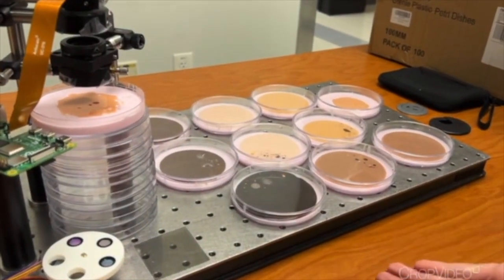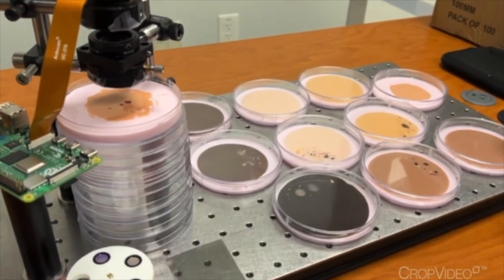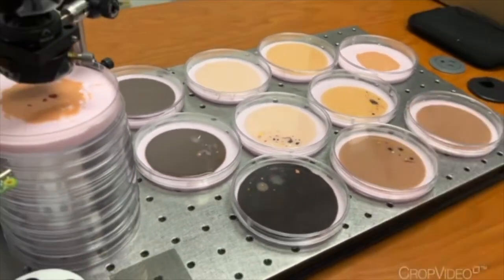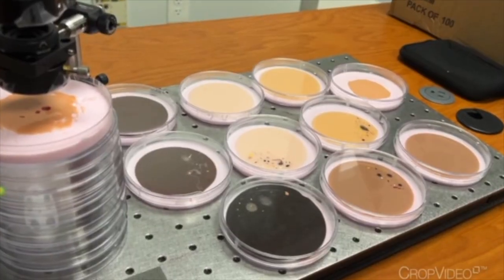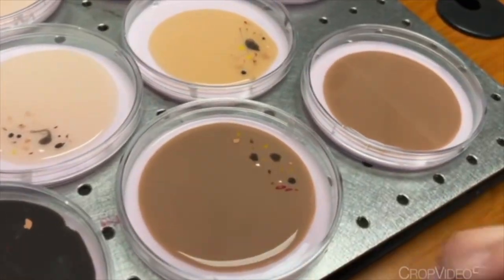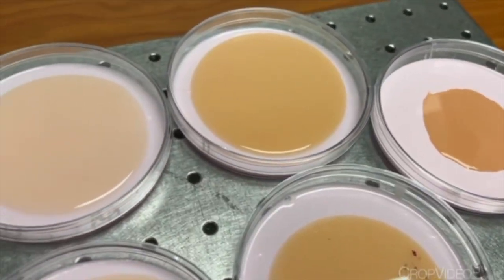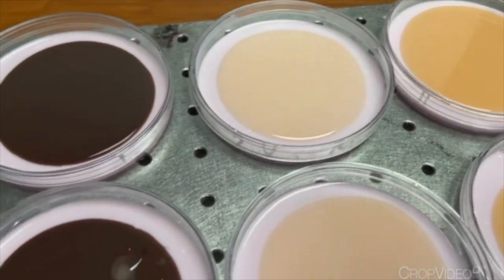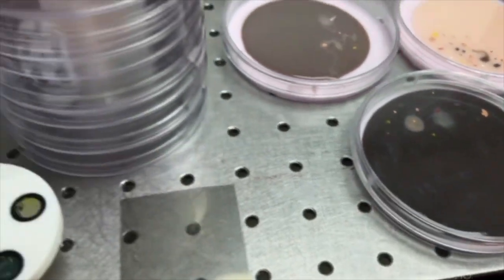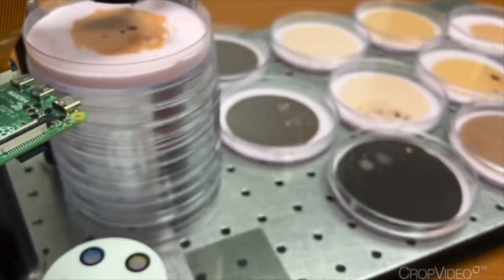So here we created a set of layered silicone phantoms to use in place of live subjects for our preliminary testing. So this is one of them here. The phantoms shown here in the petri dishes, they all represent different skin tones that we controlled by adjusting the amounts of silicone pigments and titanium dioxide mixed in to mimic the light scattering that occurs within human skin. Each phantom was cast in a 9.5 centimeter diameter petri dish and contains a thin pigmented epidermis layer between approximately 0.3 and 1.2 millimeters thick.